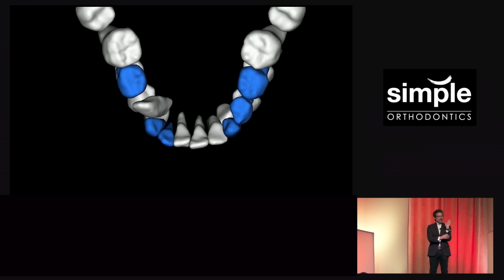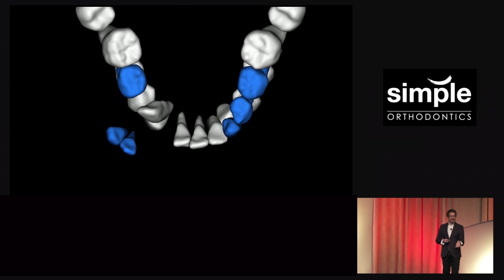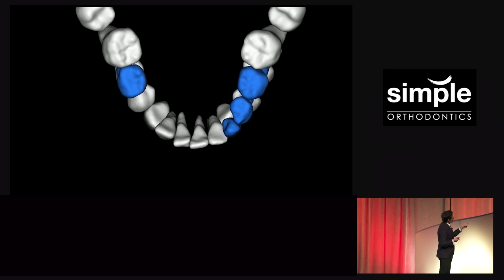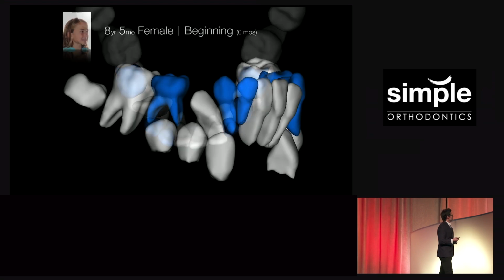A lot of us think that these teeth just upright with controlled tipping right around the apex. They don't. There's a center of resistance with impacted teeth, just like with teeth that we move into extraction spaces. So to get bodily movement on a tooth like that, I want to know how heavy I have to lift. Seeing where the root needs to move and how much moment or counter moment I have to put on that tooth allows me to design better mechanics.